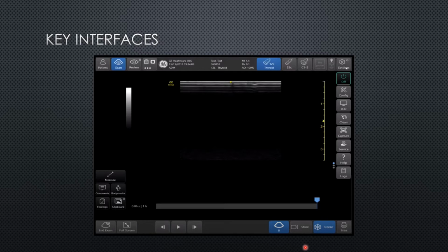And then also, if, for example, you were moving the probe, or the patient coughed or did something that caused the image to be unclear in the beginning of a clip, you can cut down the front of the clip so that it's only showing the meaningful part and not, as someone I worked with in the past would describe it, an oopsie clip or a seizure-inducing type clip where you're showing lots of motion on the screen and it just is hard to concentrate.